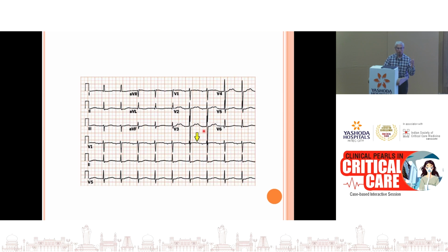But often when we ask, okay, what is the potassium? We hear, oh, the morning potassium was normal, but the ECG now shows this. You are almost 100% sure that you are dealing with hypokalemia.